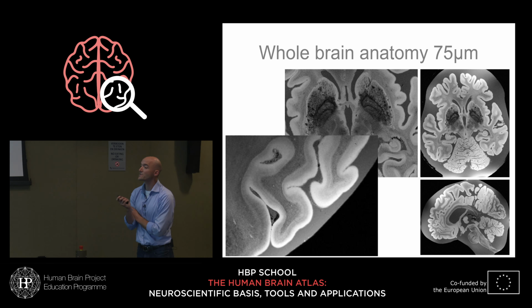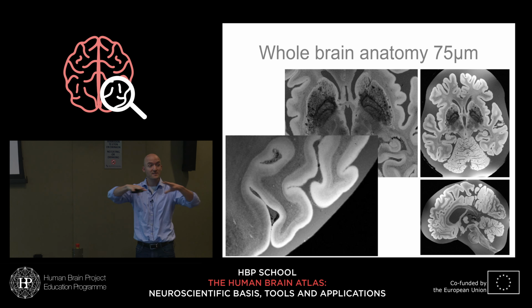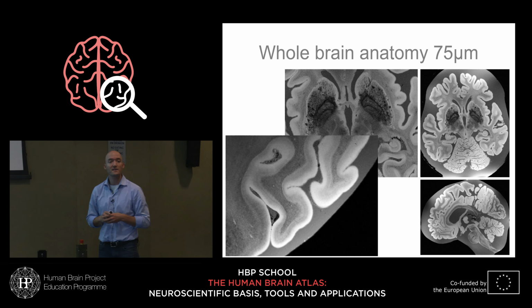And here you have a data set that has the contrast and also the field of view and the integrity. This is not 5,000 sections, but it's an intact 3D data set that you can slice in any oblique way that you can to investigate myeloarchitecture. So that is one of our interests to work on in the coming while.